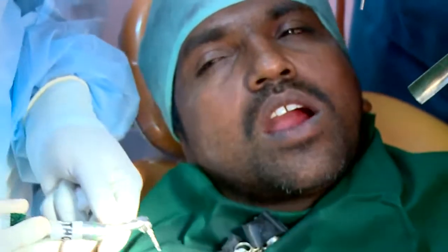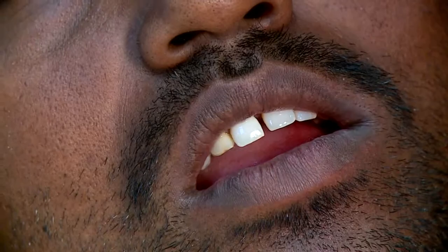So I have put that drill on. Similar protocol. You can see that the markings come through again. We are going to go through the third marking, which is our 11.5, which is what we have planned for this patient.